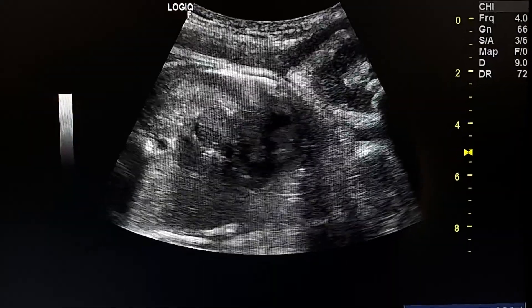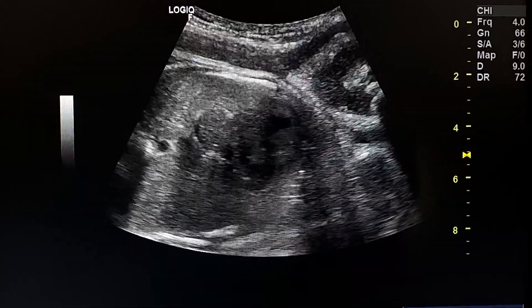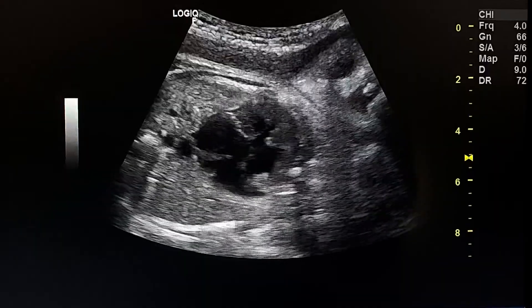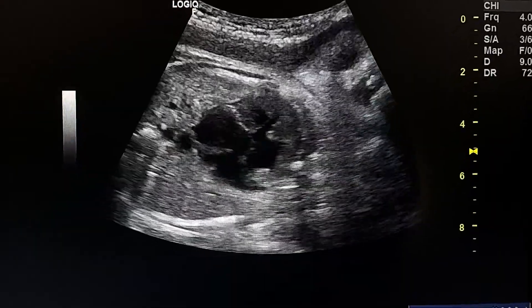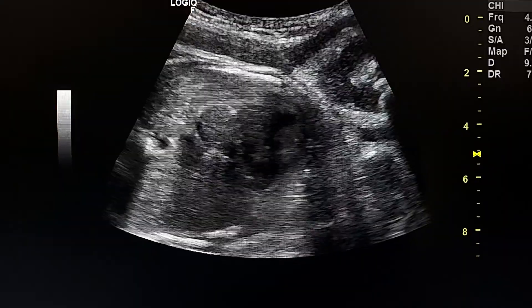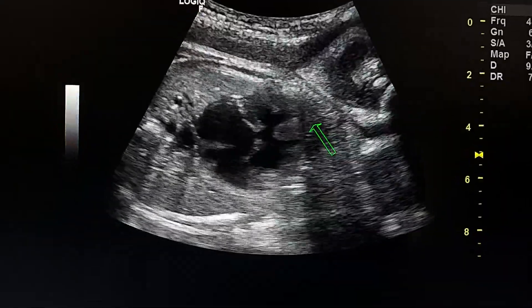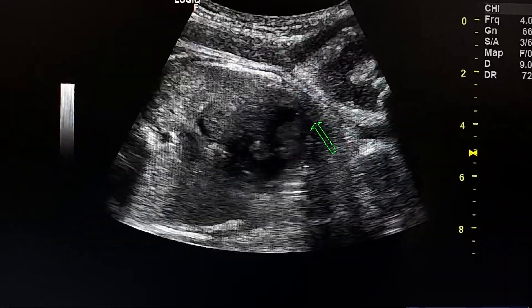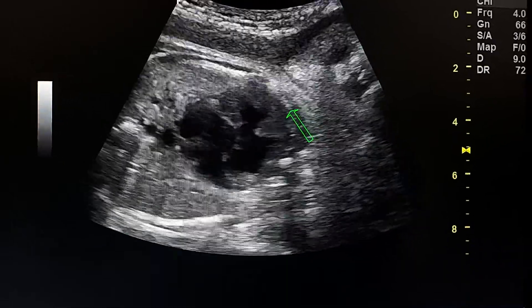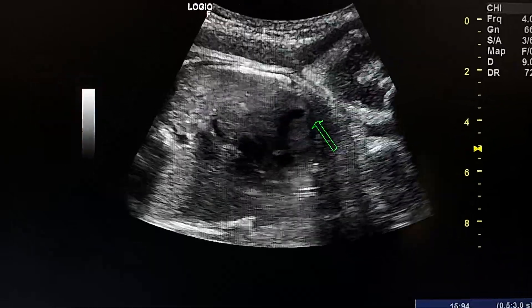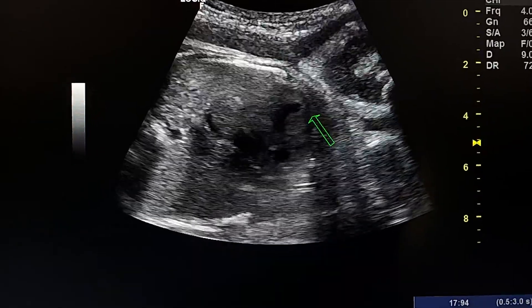This is a case of a 36-week fetus with oligohydramnios. The anomaly scan shows the four-chamber view. We see the apex of the heart towards the left, so we have levocardia.